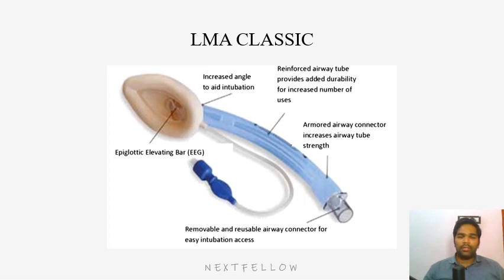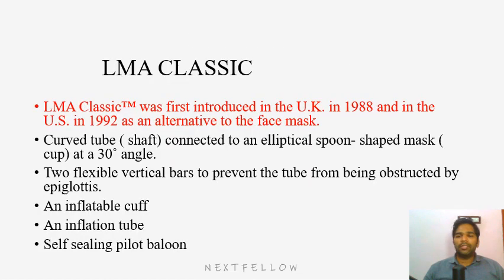So this blue color cuff and balloon system is called as pilot balloon. So it can be used to inflate this cuff. So basically this is the structure of LMA Classic. So we'll see the salient points.